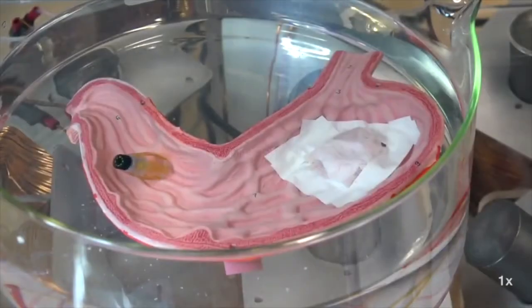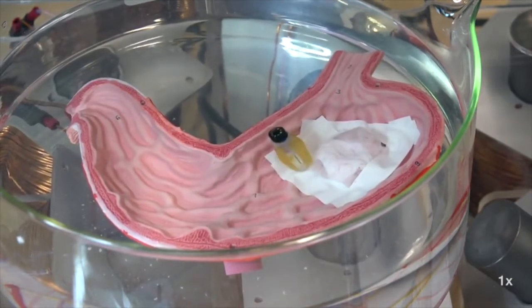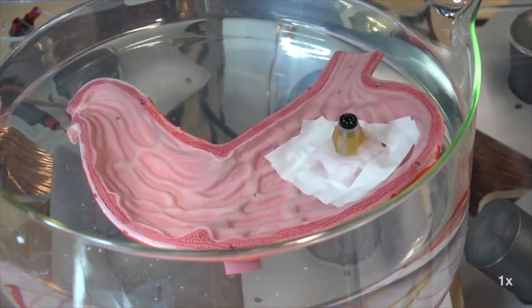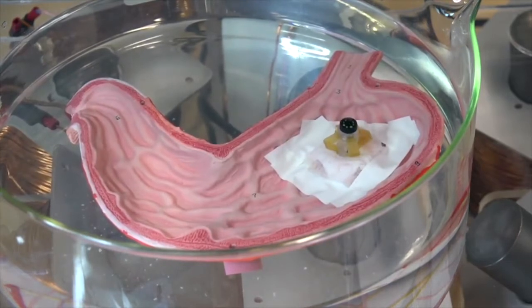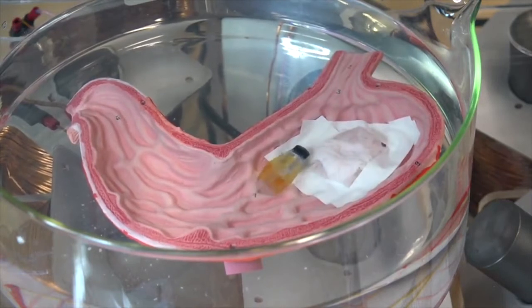We have demonstrated the robot's biopsy functionality with a biological tissue sample on a plastic stomach model in water. Precisely controlled rolling locomotion leads the robot to the sample. Once the robot reaches the sample tissue, it performs a repetitive collapsing motion, jabbing the fine needle inside the tissue. After the biopsy, the robot is free to continue further operations.